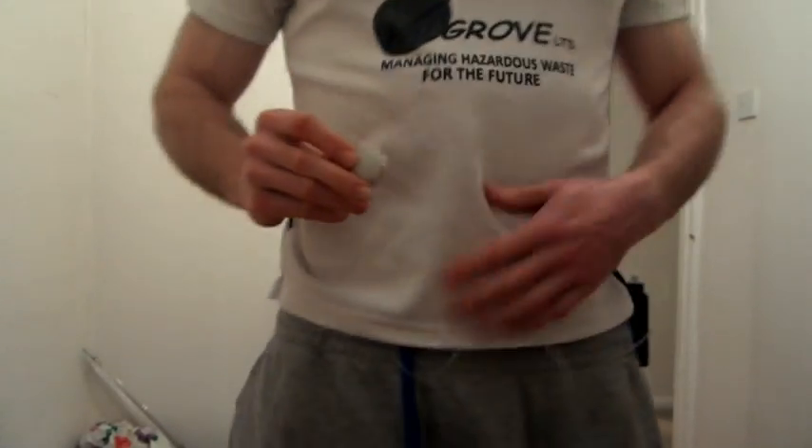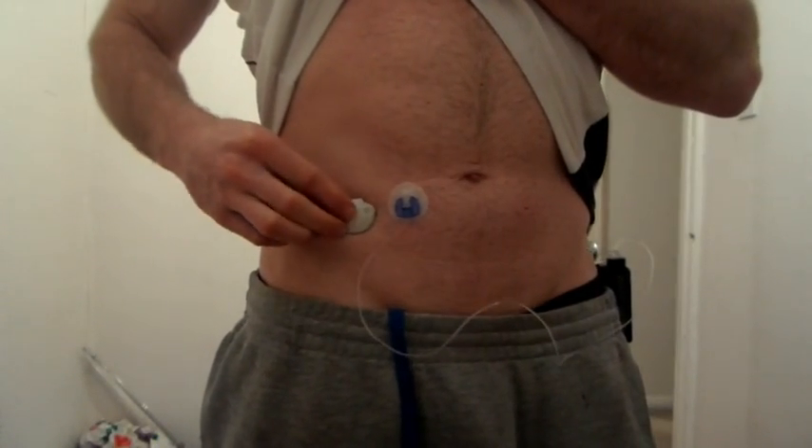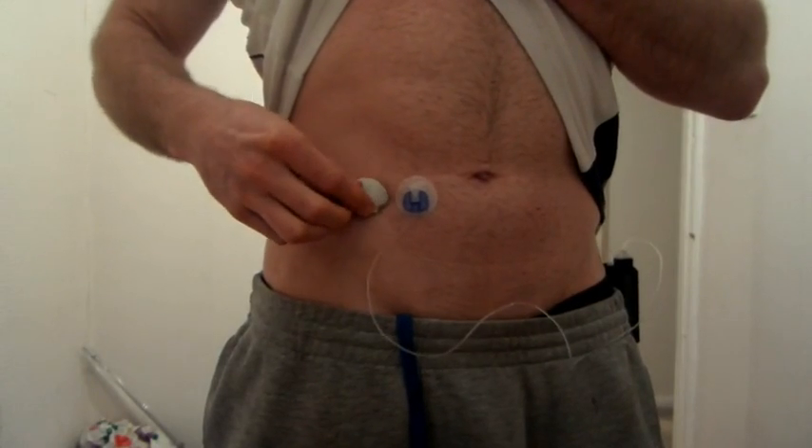The first tip is about how you orient the sensor. In most Medtronic videos and how most people place it, the mini link comes out at the side — so if it's on your stomach, it points sideways. The problem is that when you bend and move, it moves backwards and forwards a lot more, causing the sensor to potentially pull out. The suggestion is to insert it so the mini link is either up or down — portrait rather than landscape.